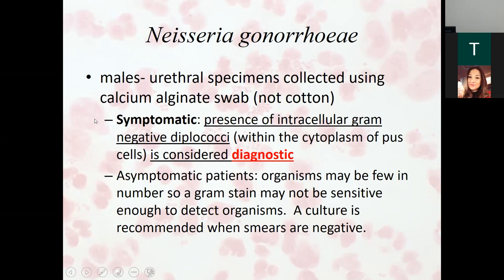And we see this a lot with strep, okay? Strep swab, well, I did a throat swab for you, could you not use that? That's what I get from nurse A a lot. I'm like, no, it needed to be rayon. The kid had a rayon swab and we can't use cotton. We needed a rayon swab. What's the difference? Well, the rayon is designed to pick up the antigen of the strep a little better than regular cotton. Might work, maybe work, it could work, right? But it's not designed for that. The kit's designed with rayon swabs, not cotton swabs, okay? And rayon's a synthetic, it's not a cotton.